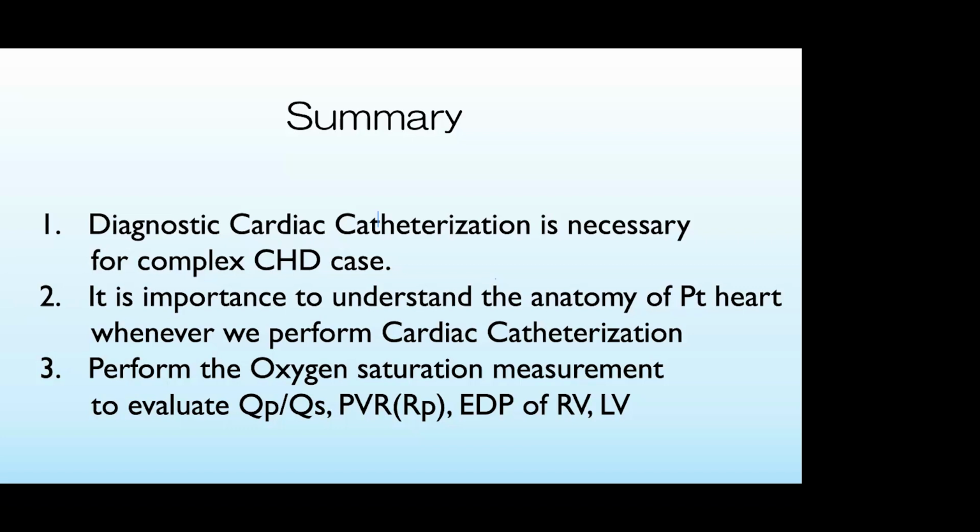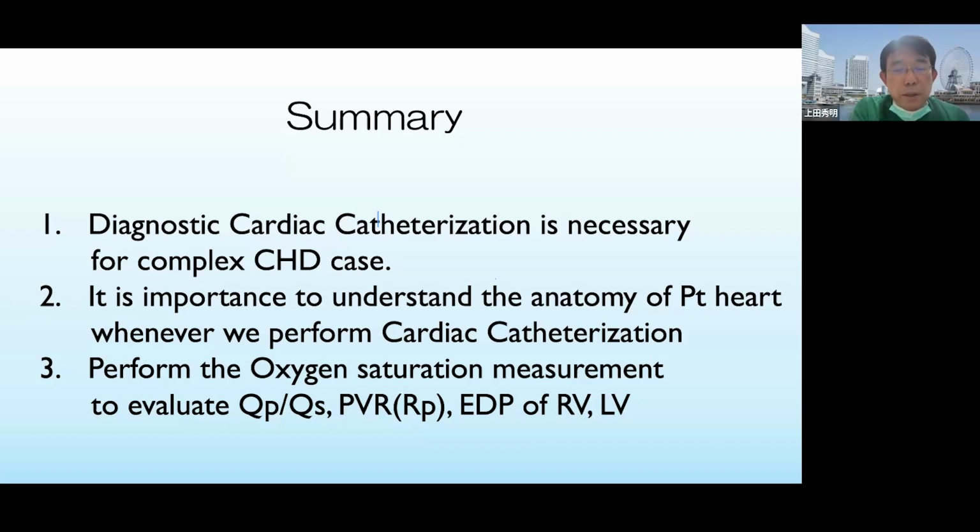Thank you for the question. I think it's a very important point because if it is a very critical case, or if we want to do it very carefully, we just divide it in two. We only perform the diagnostic catheterization to check whether the case has an indication for further catheter intervention.